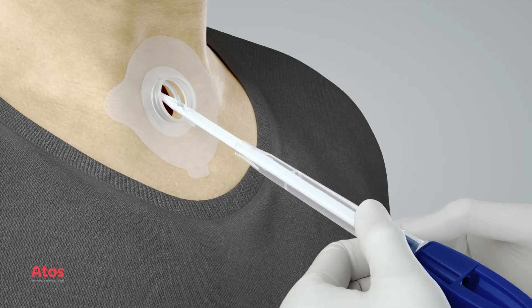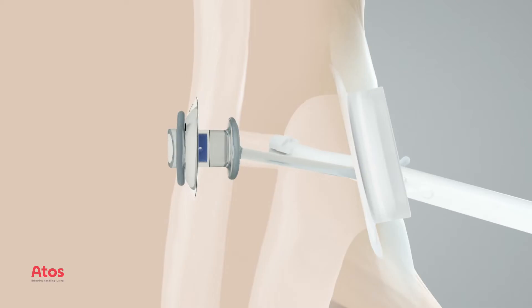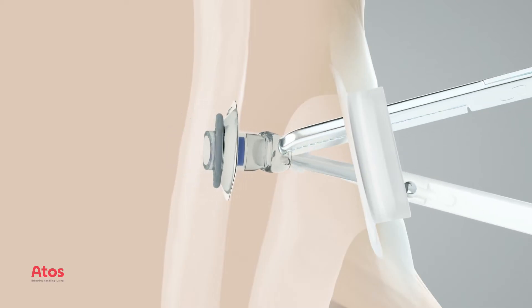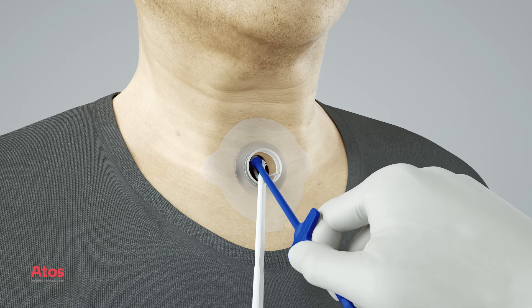Pull the loading tube and folding tools straight out from the puncture. Grasp the tracheal flange with a non-toothed hemostat. Pull and rotate the voice prosthesis into place. Brush the voice prosthesis with the Provox brush.